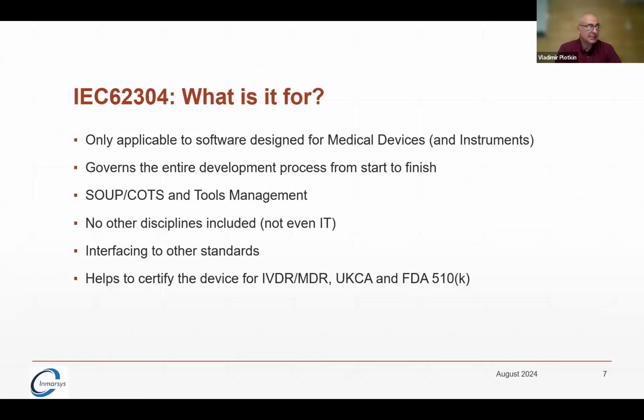Other disciplines are not quite involved. IT, for example, is not part of 62304, although there is some document and tools management, configuration items management, where IT will be involved, but under the guidance of the software department. There are several other standards that IEC 62304 interfaces with, and we'll be talking about them in a minute.